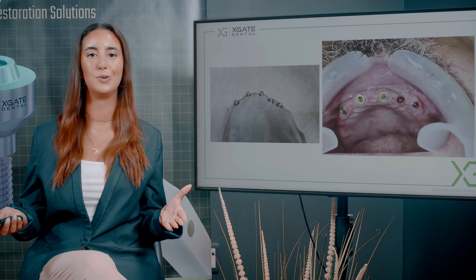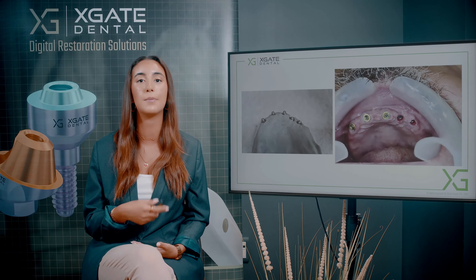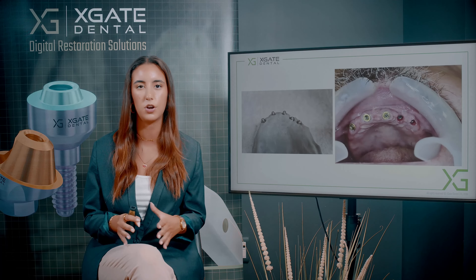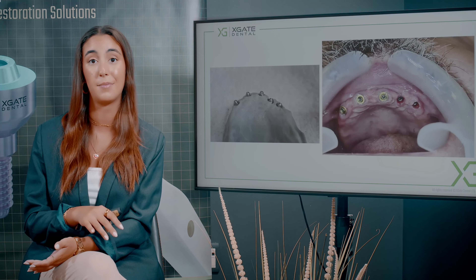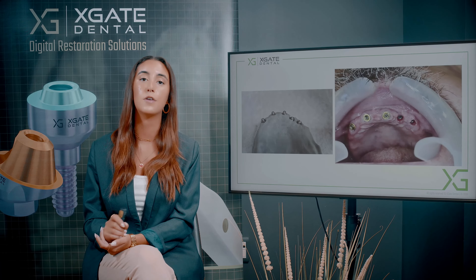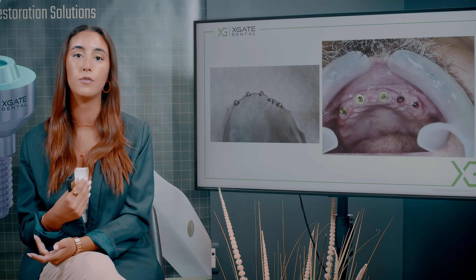Why use smaller multi-units? The smaller multi-units used for this case have an overall diameter of about 0.5 millimeters smaller than standard. Standard multi-units on the market are about 5 millimeters in diameter; the multi-units used here are about 4.5 millimeters. The diameter of the body is 4.5 millimeters, and the pillar will be smaller at its base — and not only that, the cone of the multi-unit is also smaller.